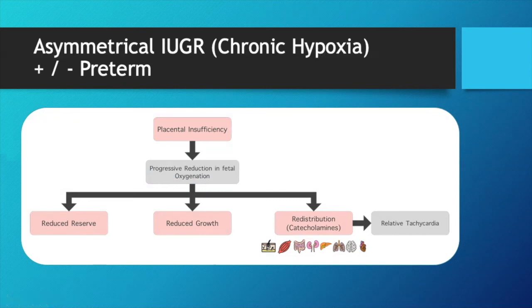Okay. So that's basically preterm and IUGR in as small a nutshell as I can make it.